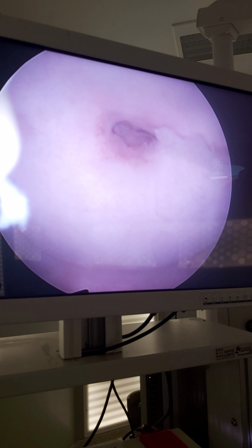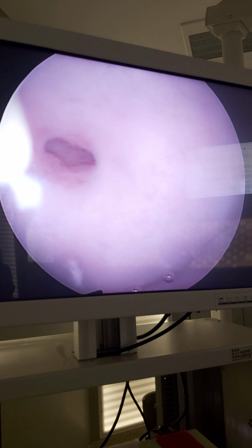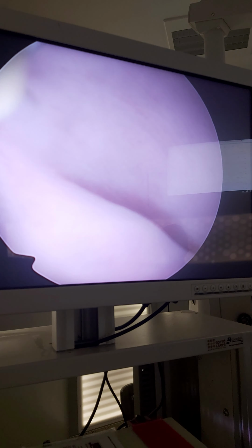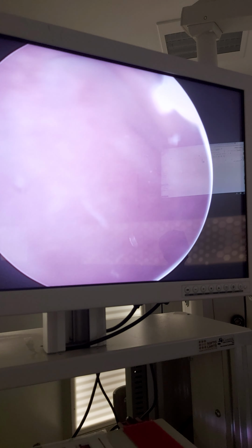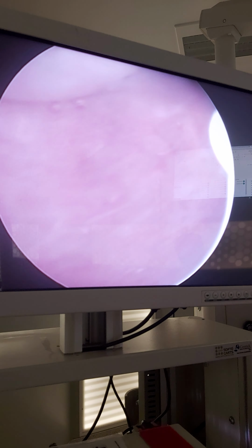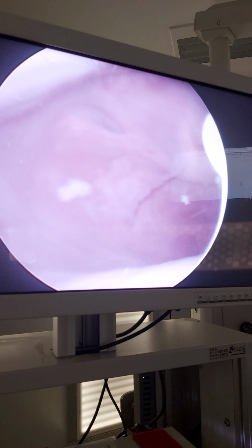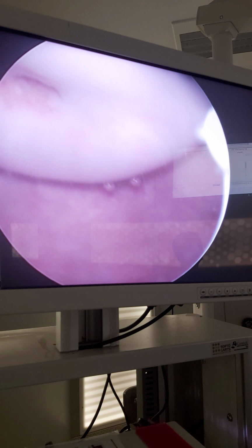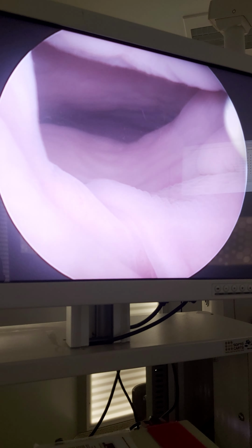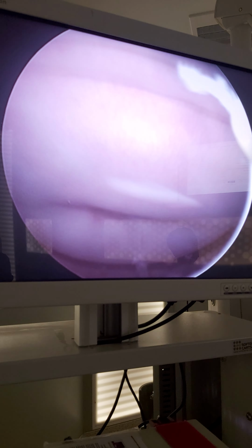Okay, here, this is the cervix uteri. It seems completely healthy, no inflammation, nothing. There is a synechiae, maybe from some stitch, maybe something, but it seems healthy, no problems. But there was a little more than normal vaginal discharge. We cleaned them. Otherwise, the vagina is normal.